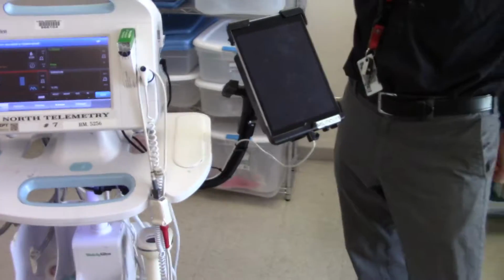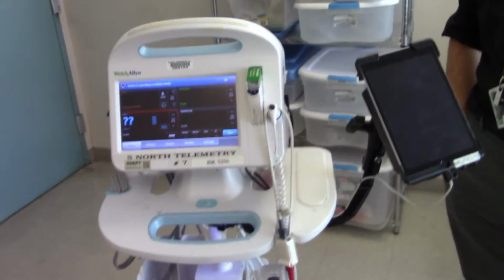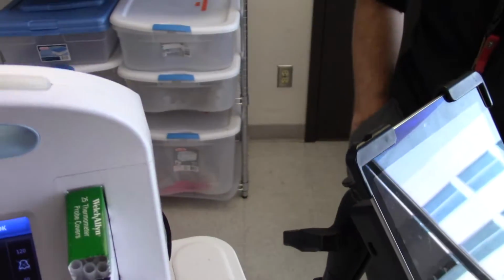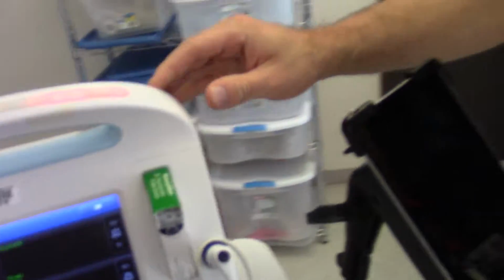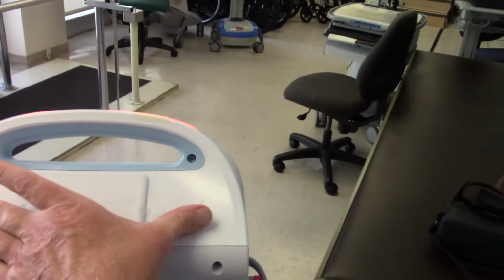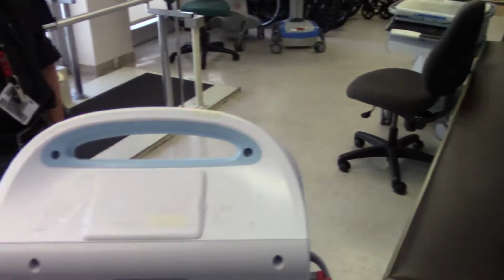So this thing is on the side and it's getting whacked on doors going through all the time. Correct. Okay. Is there any possibility that we could mount something, somehow coming up from the top? You could. I think we talked about that originally when we were speccing out. If we had a couple of big pads that came up here in some kind of unit with the iPad on it, then it wouldn't be on the side.